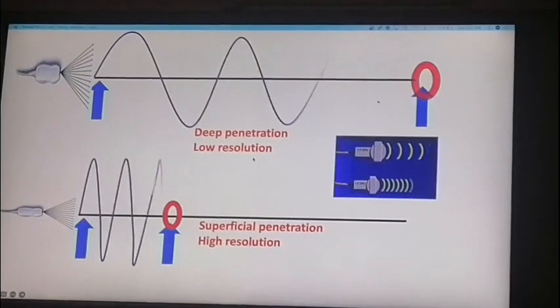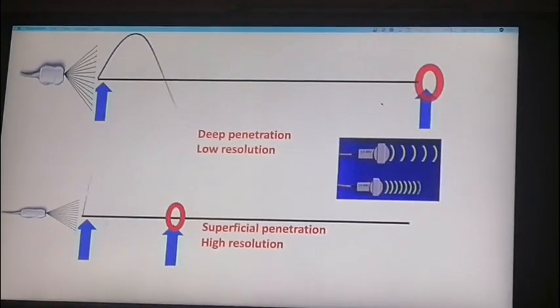So how does the machine do this job? The electricity that we have has a frequency for any TV or any kind of electric device. There is a fixed frequency all over the world, 50 to 60. If you check any kind of device, 50 to 60 hertz, not megahertz, hertz. So the machine will convert the commercial electricity into high frequency, as per the requirement, 10 megahertz or 20. So 10 megahertz means 10 million. So it converts 50 to 10 million.